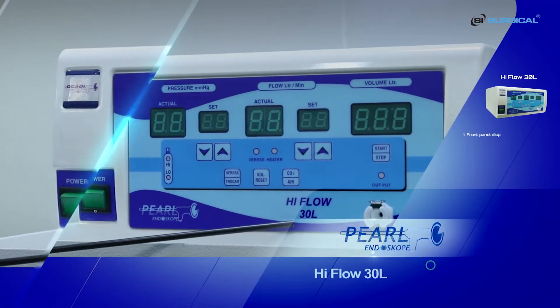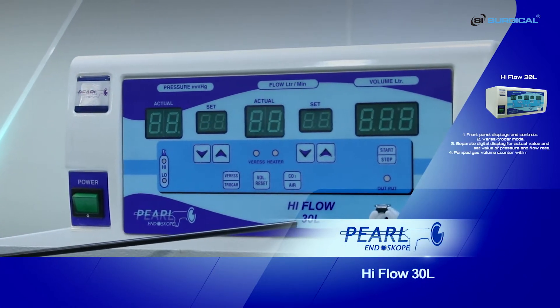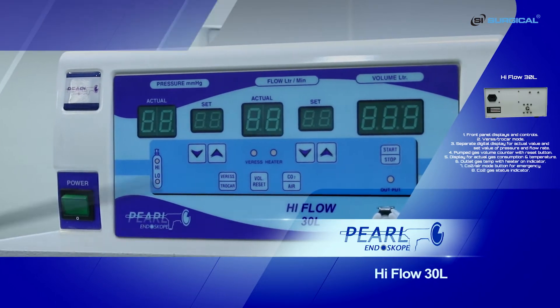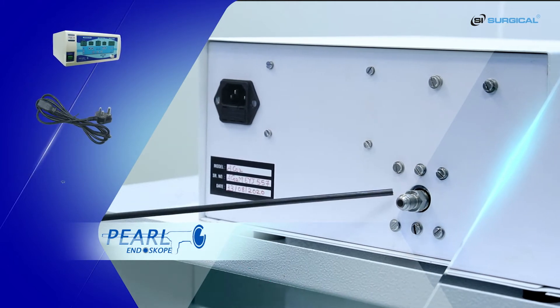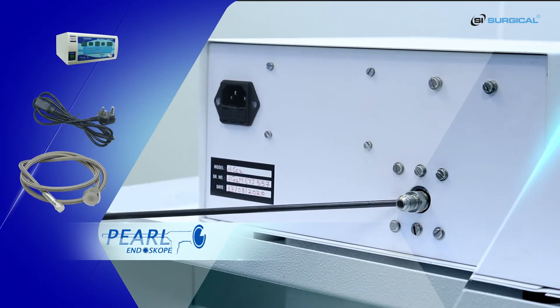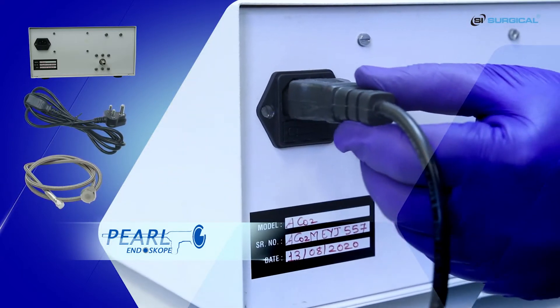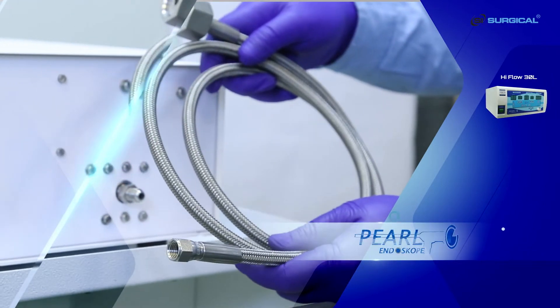This is a demonstration of the HIFLOW 30L. This is the power cable connection port. This is the gas inlet port. This is the CO2 gas inlet pipe.